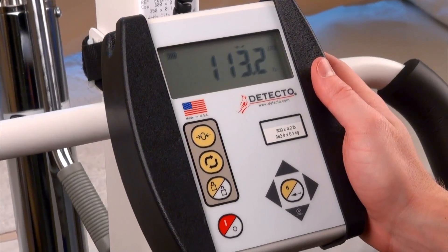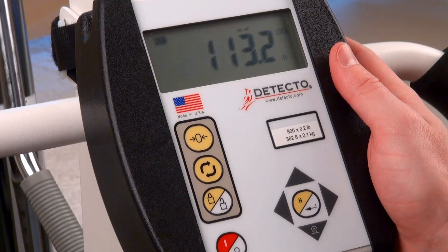Once the weight is stable, it will be automatically locked in on the indicator and remain that way until the lock release key is pressed.